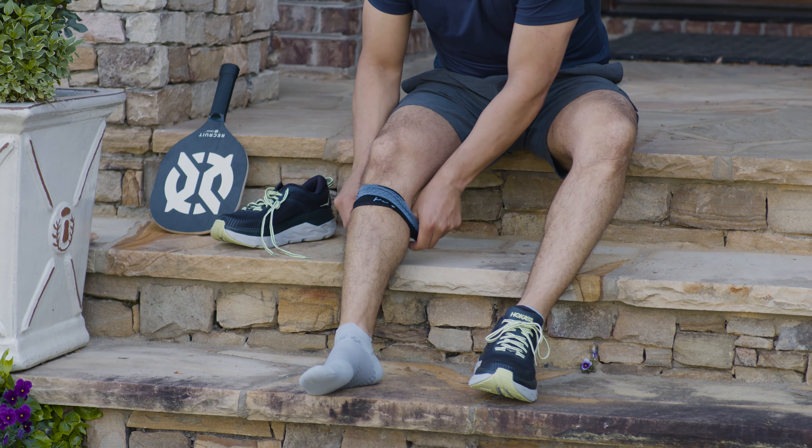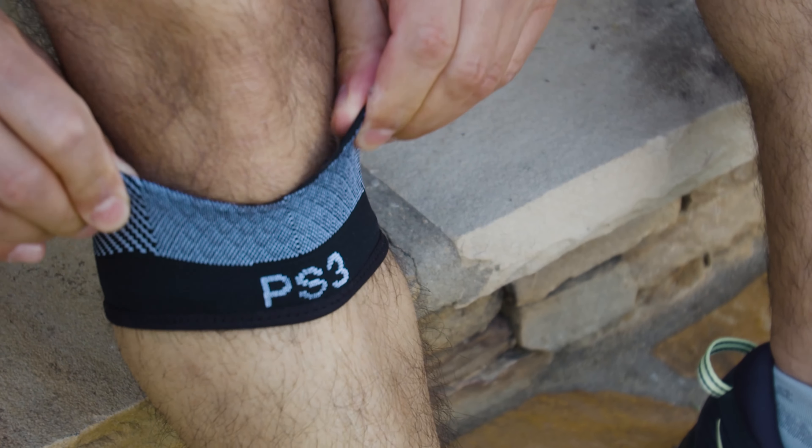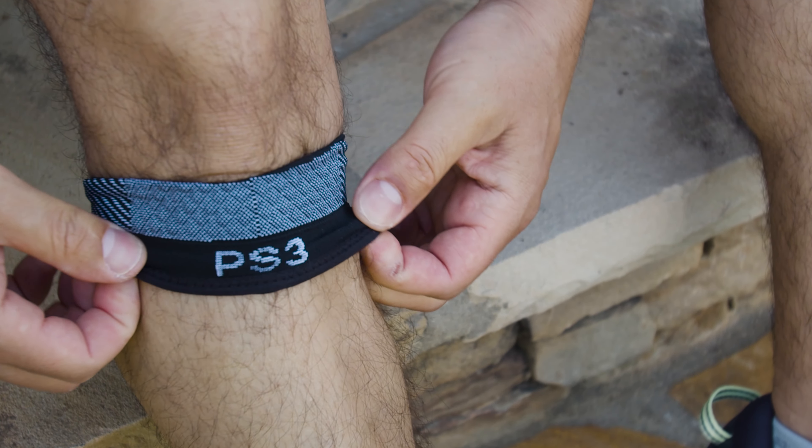Slipping on the sleeve should be easy and simple. Pull the sleeve up and over your calf. The compression should then take hold.